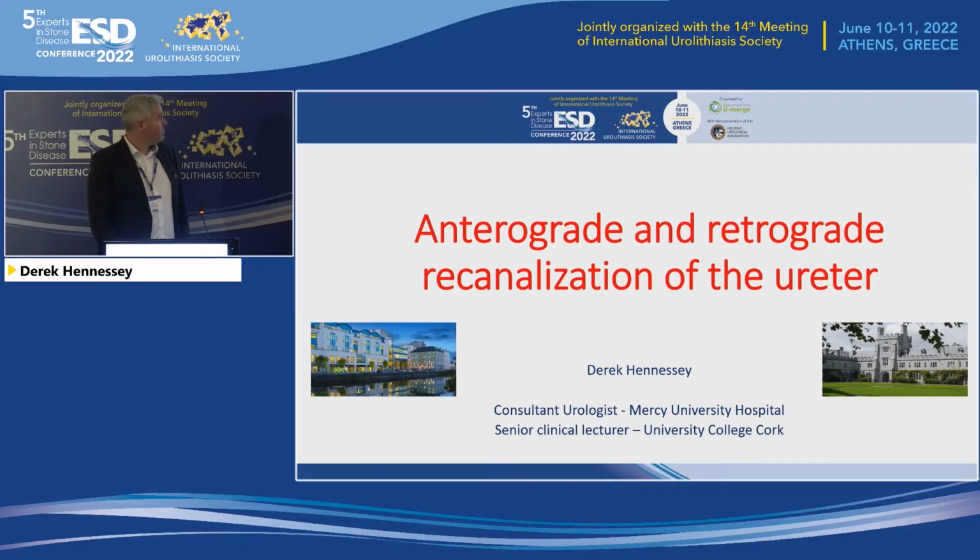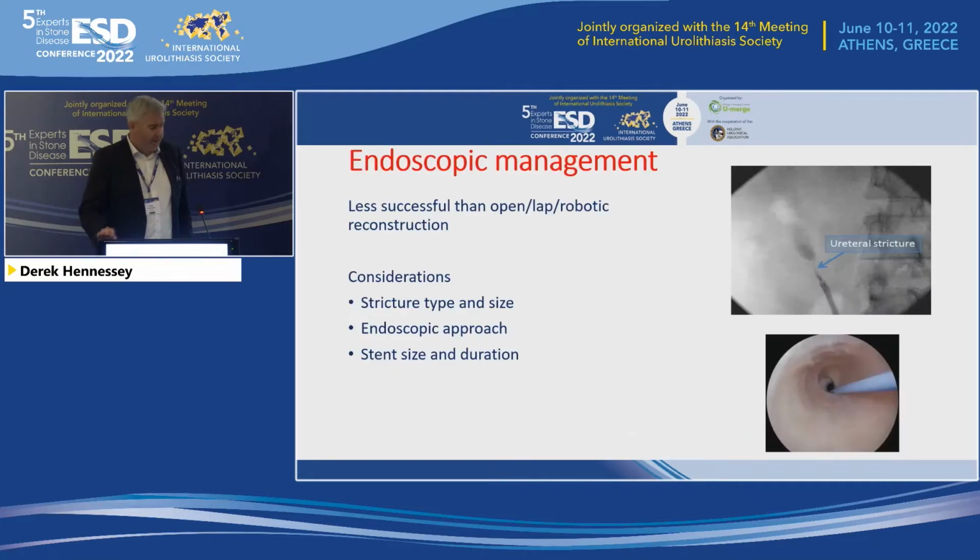So today I was charged with the antegrade and retrograde recanalization of the ureter. When I was charged with this, I was a little bit nervous because my knowledge of this topic was limited, I felt. So the first thing I did was I searched the literature, and simply typing endoscopic ureter and stricture into Google only brings up 700 abstracts.